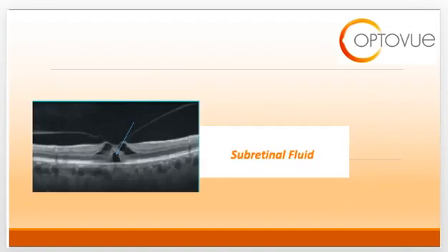Another complication involves the development of subretinal fluid. We oftentimes think about vitreo-macular traction affecting the superficial retina and the inner retinal space; however, in cases of chronic or significant traction, the outer retinal tissue can become involved, resulting in subretinal fluid formation. The hyporeflective area that the blue arrow is pointing to is this subretinal fluid. What we worry about is that the ISOS junction is usually affected, resulting in significant reduction in visual acuity.